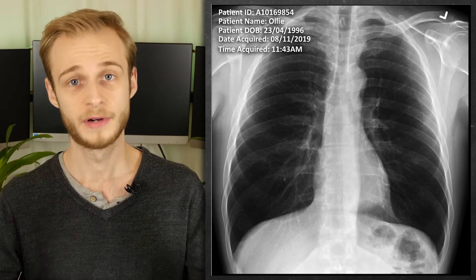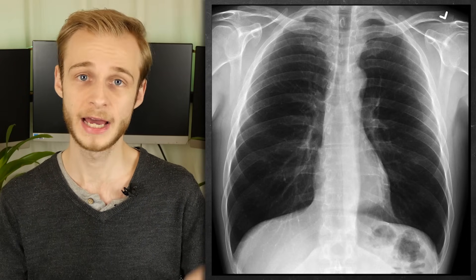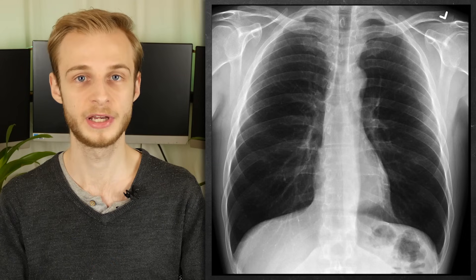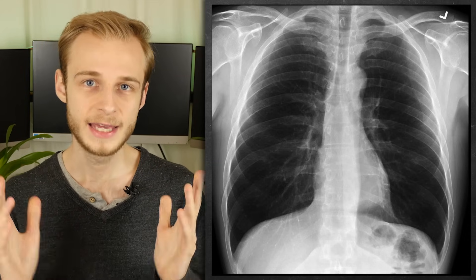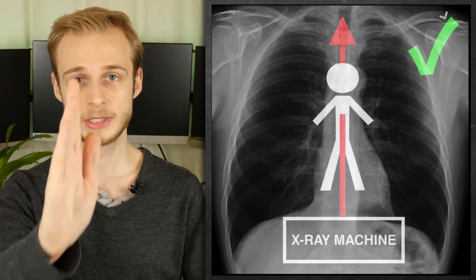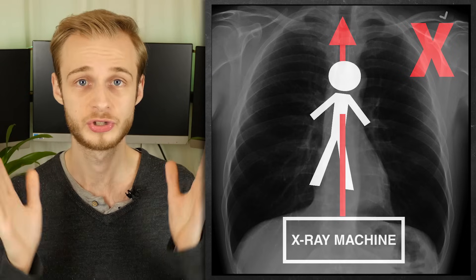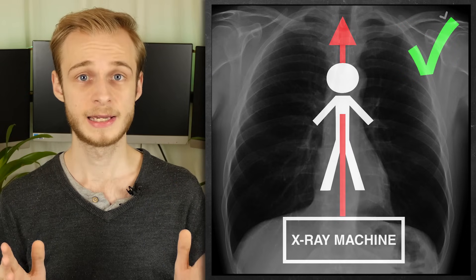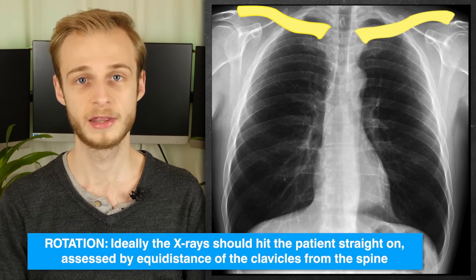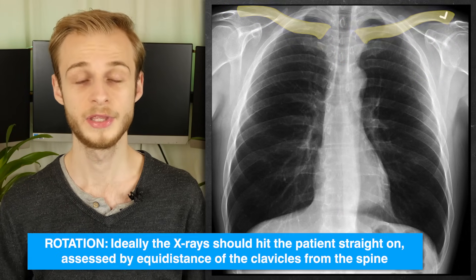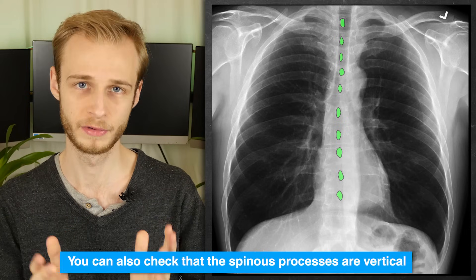The first part of our process involves assessing the quality of the x-ray image we have, and for this we use the mnemonic RIPE. We begin with R, which stands for rotation. Did the x-rays hit the patient straight on or at an angle? Ideally they should have been as straight as possible. This is assessed by looking for the medial parts of the two clavicles and checking that they're equidistant from the spine, and the spinous processes should also be vertical.